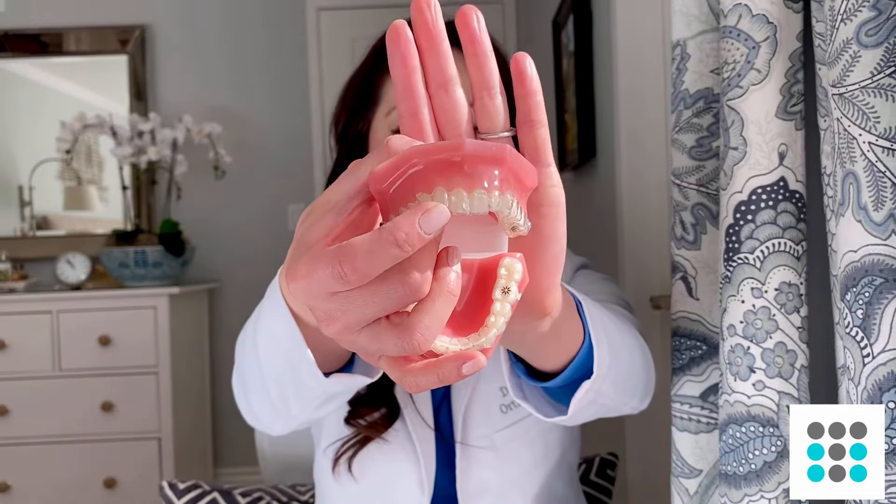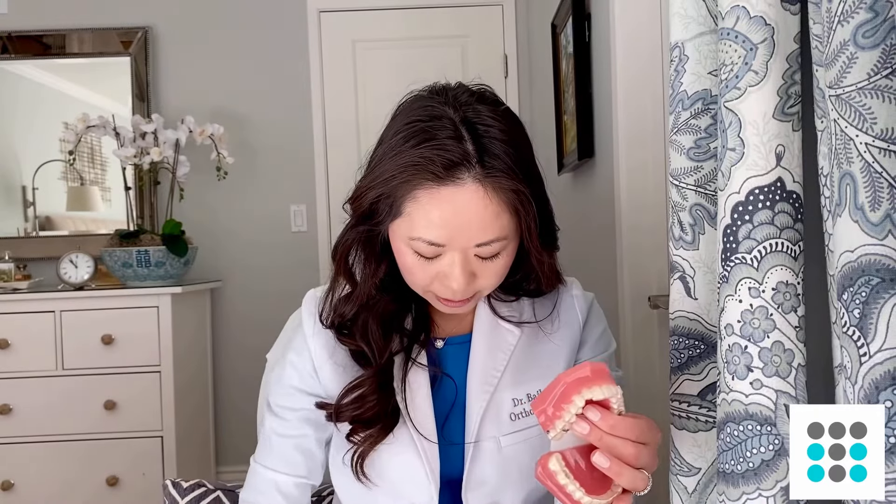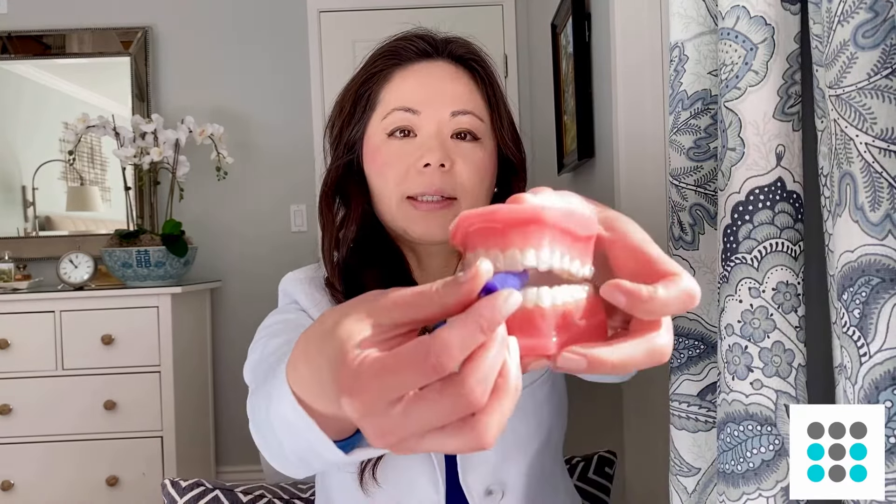If you're noticing that your lateral incisors are showing halos or they're not tracking, definitely increase your use of chewies and chewing exercises to help your tray seat better. A lot of patients will chew right where the lateral incisors are, but my advice is to also use the chewies on the centrals — the center teeth right here. A lot of times it's actually the centrals that are not intruding, and that's what's causing a halo to form where the lateral incisors are. So definitely chew on the centrals too.